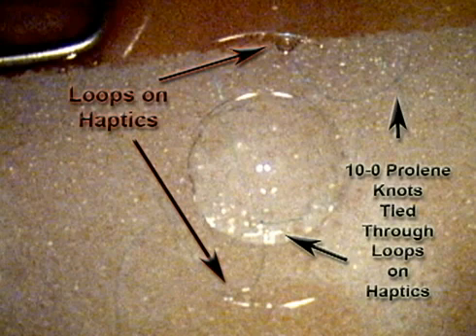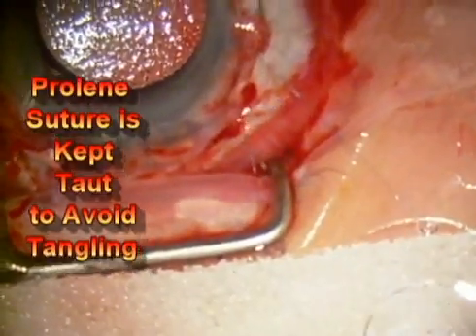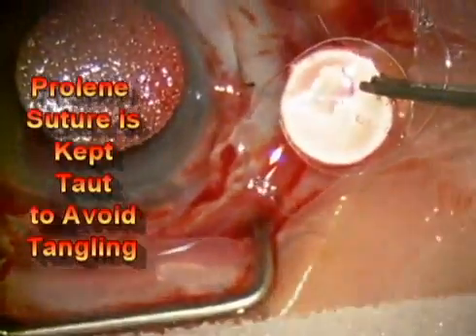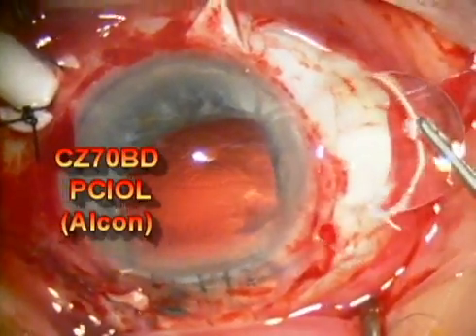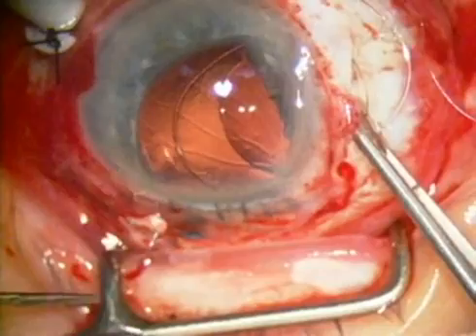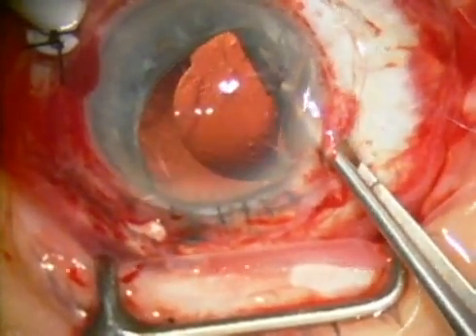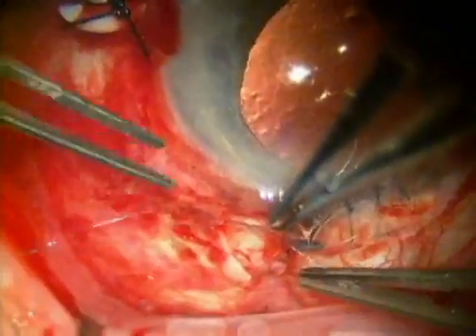This is a special posterior chamber intraocular lens that has loops on the haptics. The prolene sutures are tied through those loops, and that helps the intraocular lens to remain stable inside of the eye in the proper position. The specific model of the intraocular lens is shown on the left side of the screen. There you see the lens inserted into the eye. The sutures are kept relatively taut throughout the procedure to avoid tangling these very fine sutures.